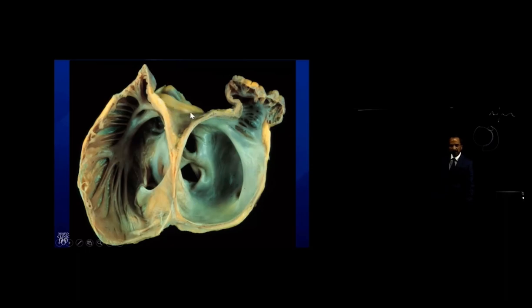And as you pointed out, in 45% of patients, it exists and may be an important supplier for the sinus node. So if we do a line there and we don't realize that artery is there, we might ablate that artery and get sinus node dysfunction. Best way to avoid it is just avoid the line.